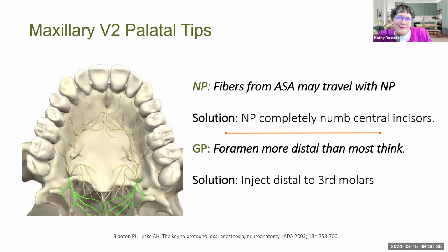My perspective is that when done with thoughtful steps, you can accomplish those palatal insertions pretty comfortably, and a lot of the discomfort is really on us. If we shift up our game, then we can leverage those palatal insertions to our benefit and the patient's benefit, and do it in a really comfortable way.